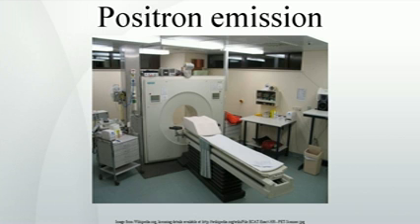PET technology for small animal imaging. A miniature PET tomograph has been constructed that is small enough for a fully conscious and mobile rat to wear on its head while walking around. This rat cap, the RatCAP (rat conscious animal PET), allows animals to be scanned without the confounding effects of anesthesia. PET scanners designed specifically for imaging rodents, often referred to as microPET, as well as scanners for small primates, are marketed for academic and pharmaceutical research.